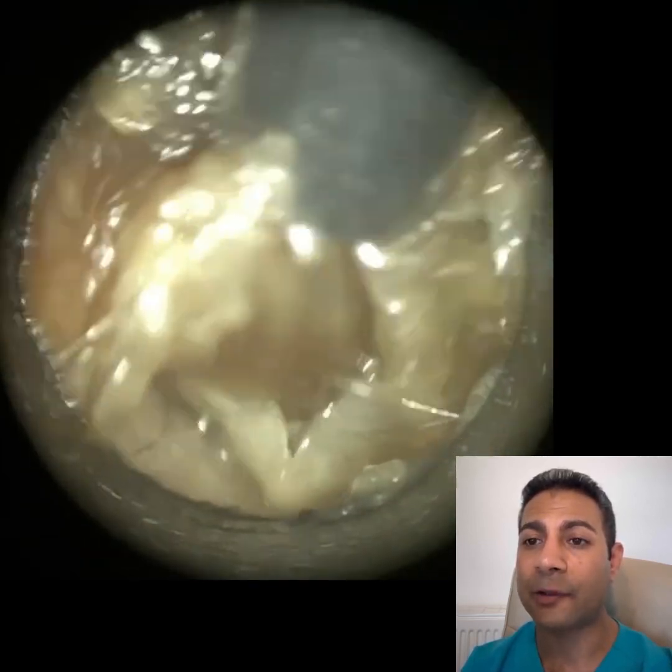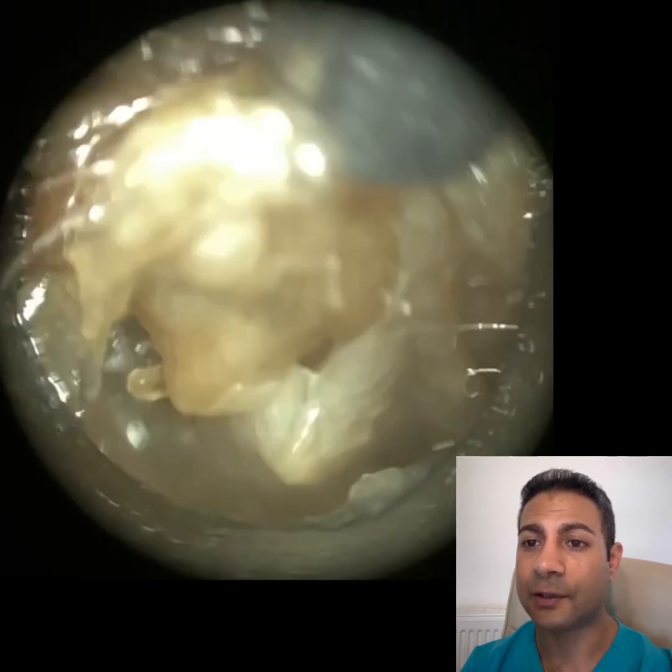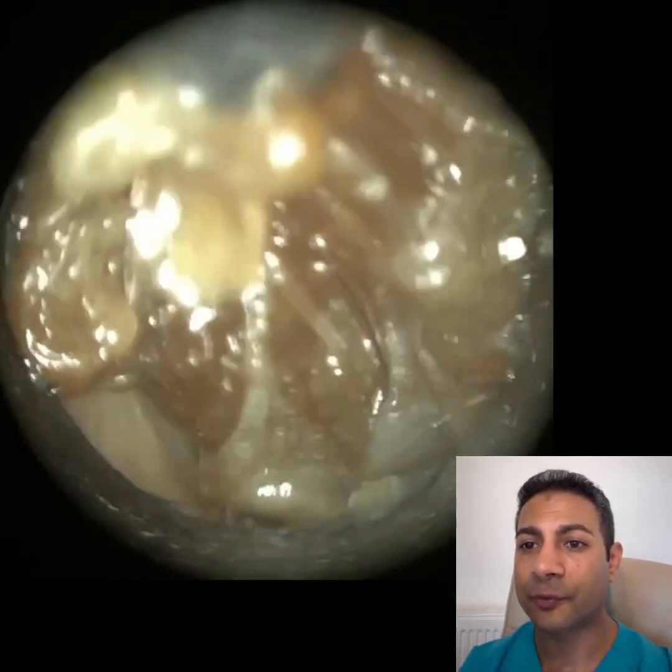And we have here a patient who attended with bilateral, fully occluding, softened earwax and dead skin. You can see this dead skin around the periphery of the wax plug. So it's a relatively straightforward procedure.